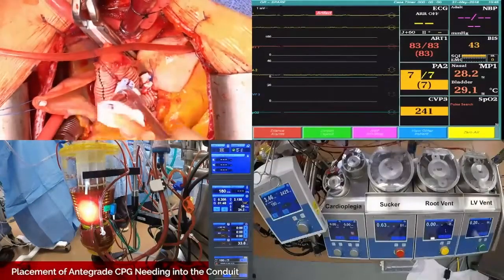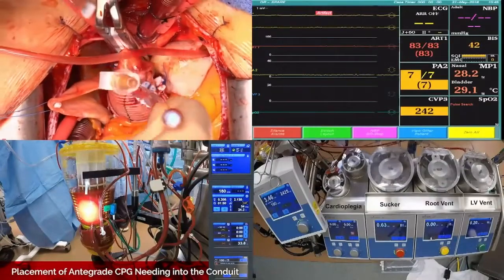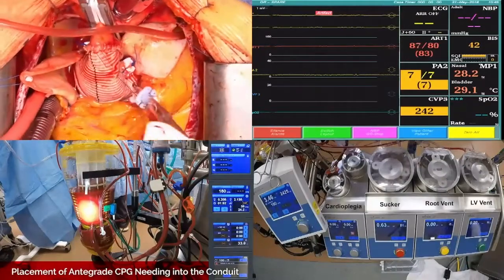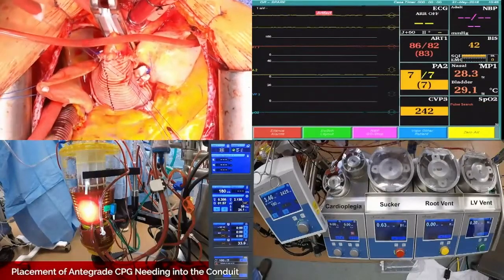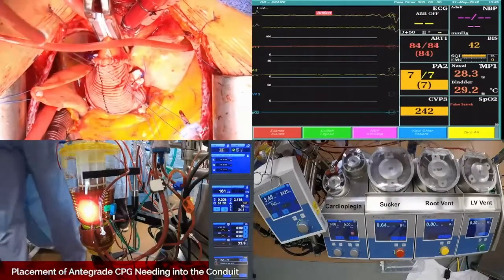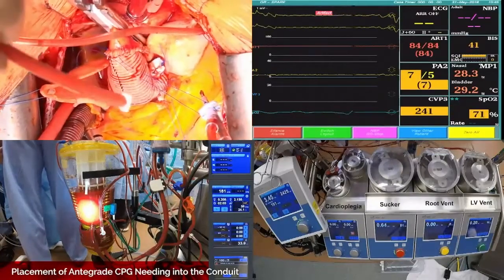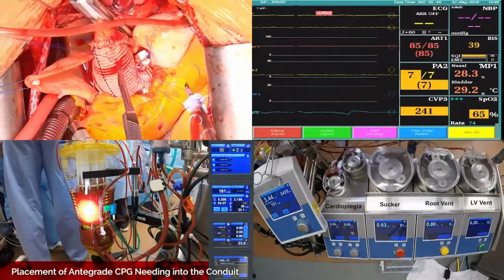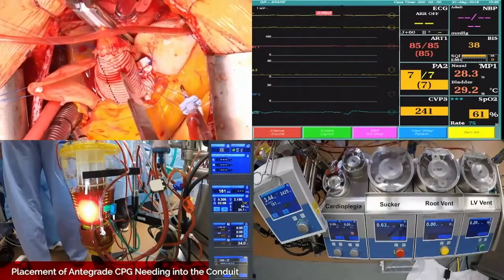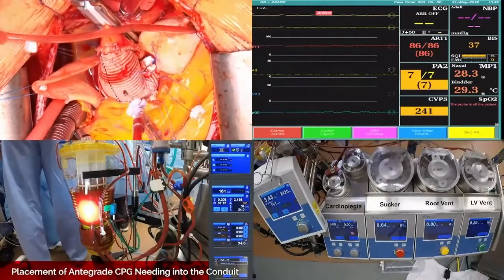Yeah. That's the problem with HemoShield Platinum. HemoShield Gold really doesn't have that problem, but for whatever reason, maybe I. So now you had a hard time getting that in. Well, it's tough. Yeah, it's not enough pressure. So if you see, I'm lifting up both ends of that horizontal mattress suture to get some purchase and some resistance. So I use an 11 blade. 11 blade, yeah, that always makes a needle hole. That didn't work very well, but just little technical things here.